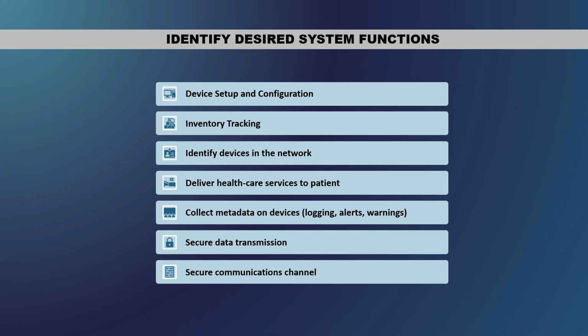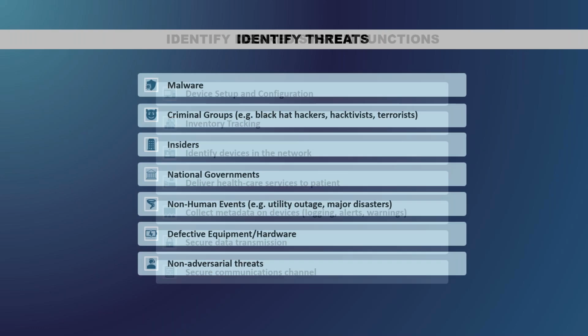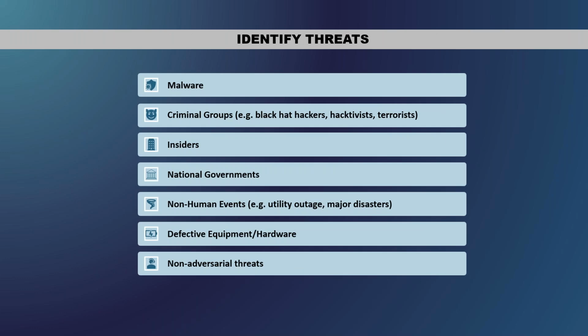The transmission of the data: how does it transmit the data? Does it encrypt it, securely transmitted at rest or in motion? And then creating a secure communication channel, which is maintenance coordination between vendors, so any external connections and remote connections that need to go into that device.